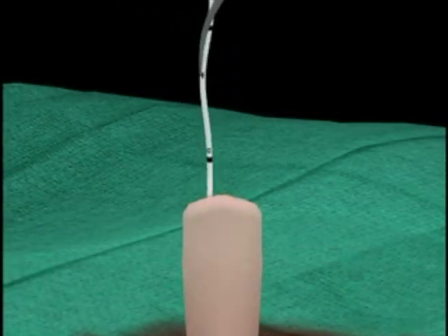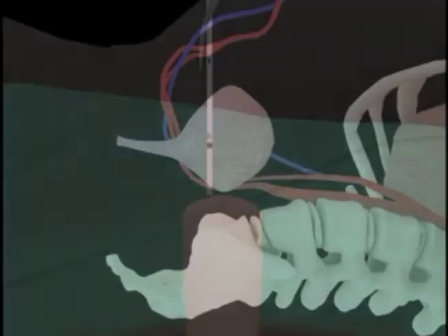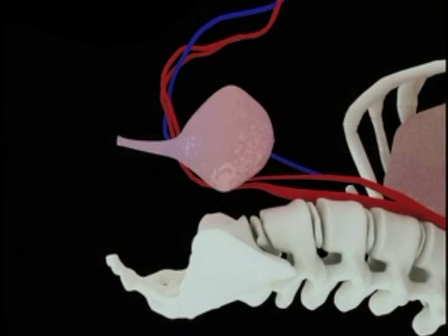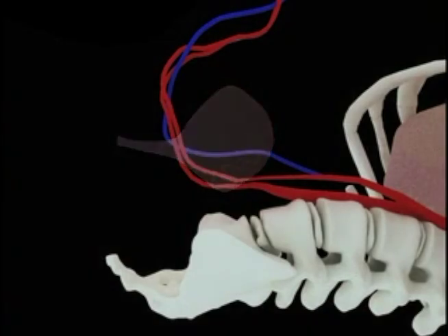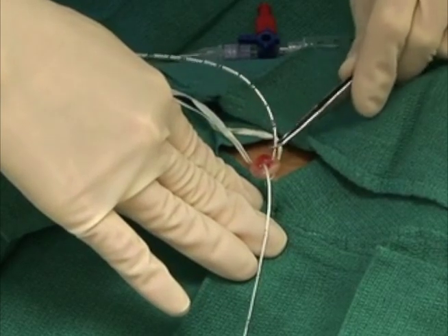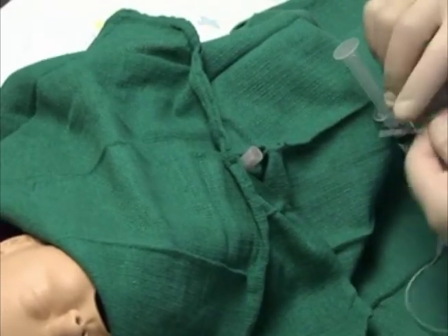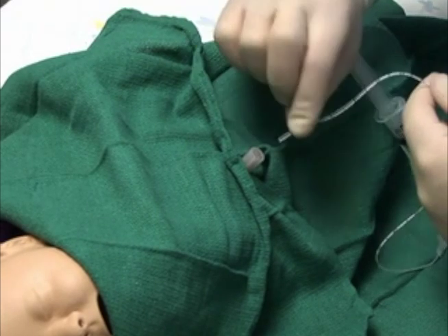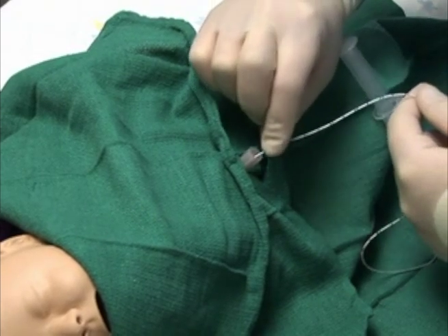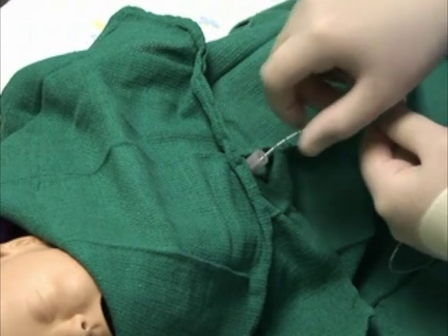If you encounter resistance at 6 to 8 centimeters in a full-term infant, the catheter may be at the curvature in the umbilical artery, curving around the bladder before it enters the internal iliac artery. Apply gentle pressure for 30 seconds. Some experts recommend positioning the infant on the side, with the artery being cannulated in the superior position, flexing the hip to facilitate insertion. In our experience, it is often best to move on to the second artery if resistance is encountered at this curvature.